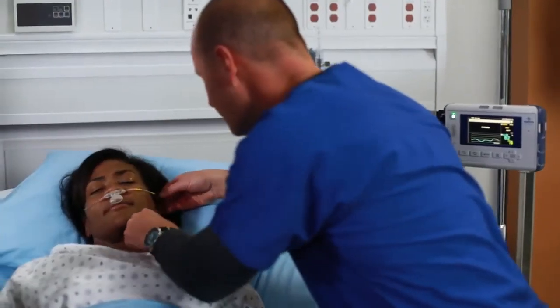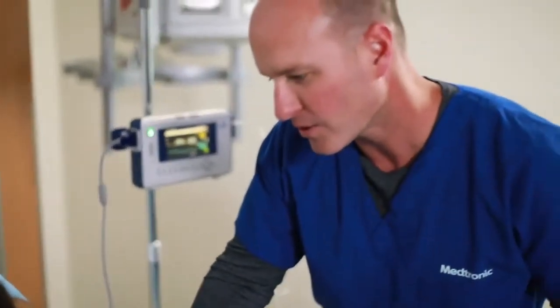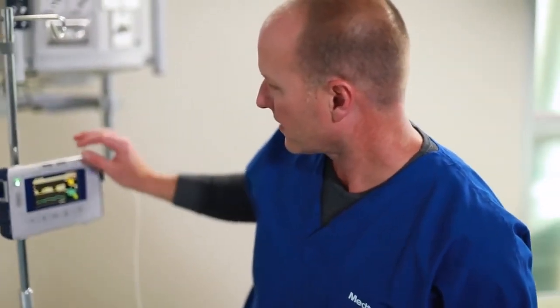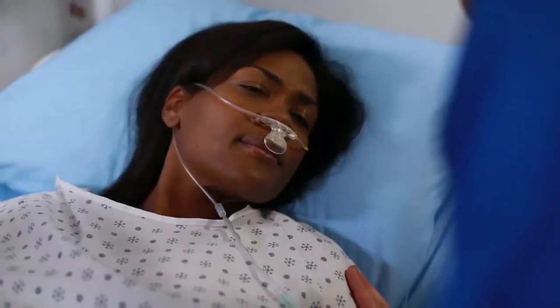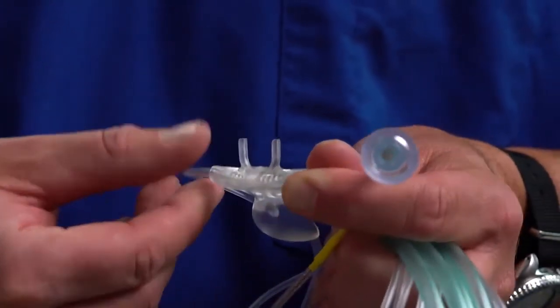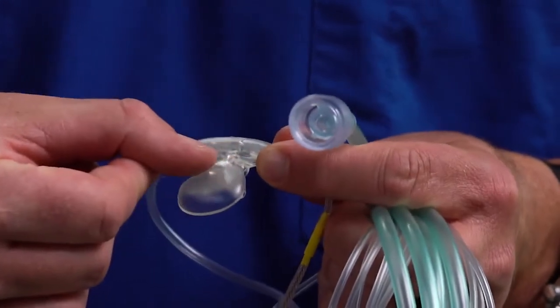Additionally, the filter line sampling line portfolio is offered with supplemental oxygen, providing delivery of up to 5 liters of oxygen per minute through an oxygen cloud that does not dilute the CO2 sample.